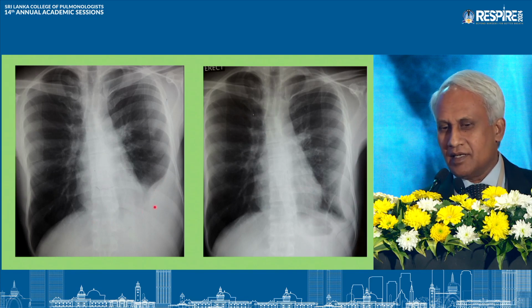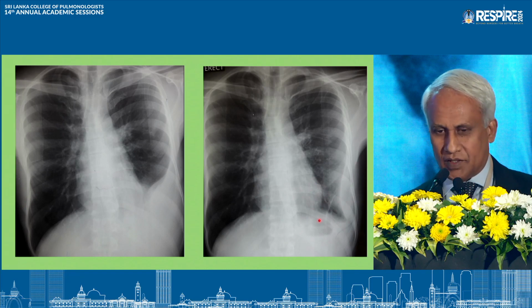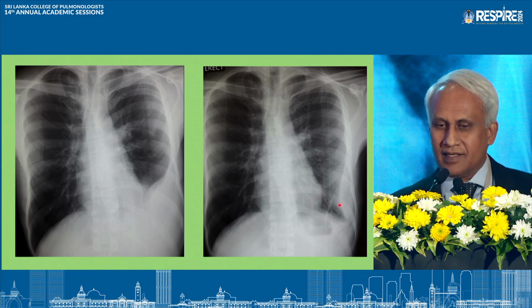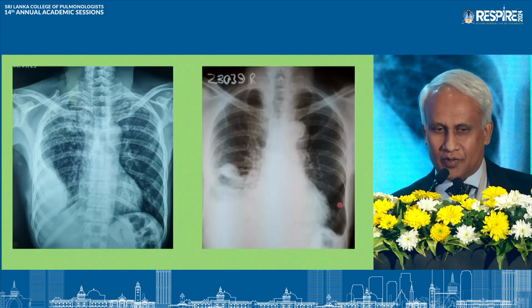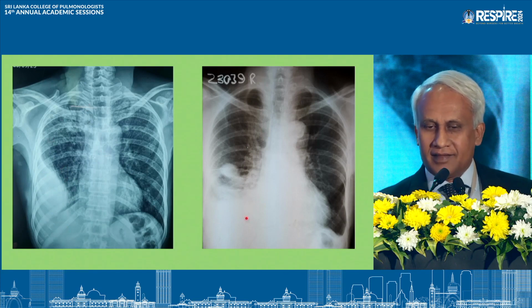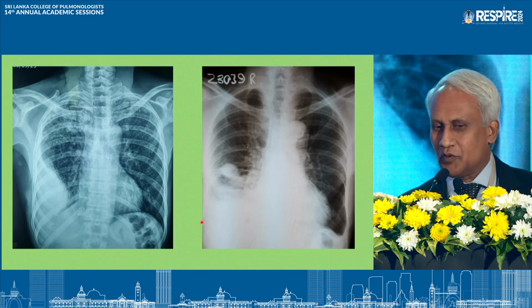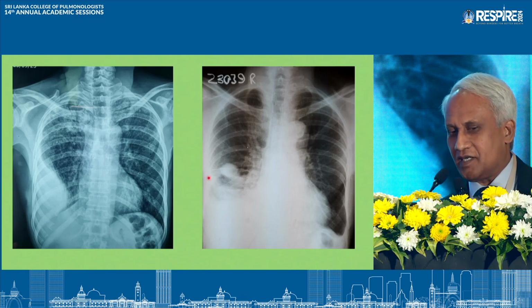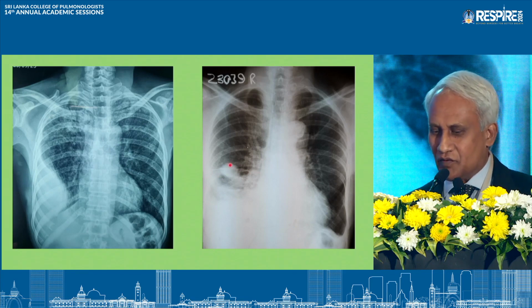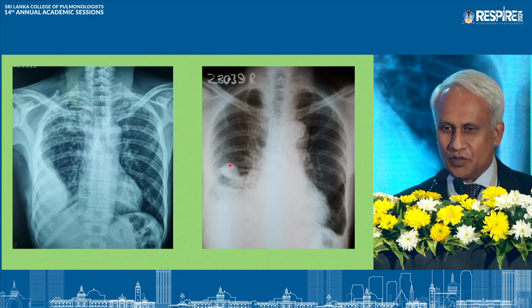See all these things. Now this one you can see the encysted fluid in the left lower zone, which is suggestive of an exudative pleural effusion, because for you to get encystation, you have to have a lot of proteins. Another patient with the pleural effusion in a TB patient. And this one, you can't see the right hemidiaphragm, right heart border. And again, there is a pleural effusion. And you can see some fluid in the transverse fissure, which is in the correct position. And then opacity here, which is suggestive of a collection of fluid within the fissures. So this is called pseudotumor appearance.